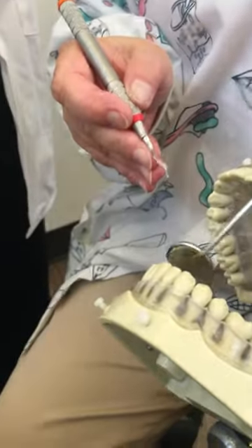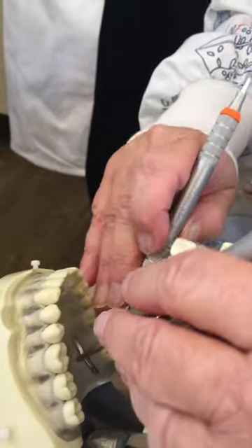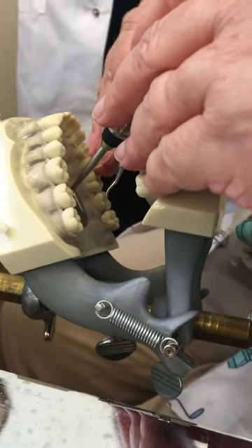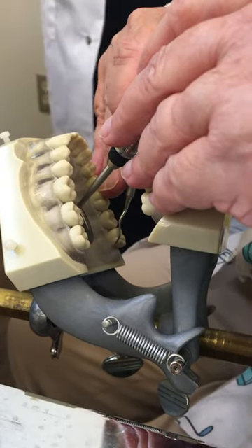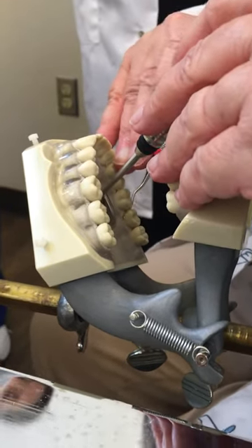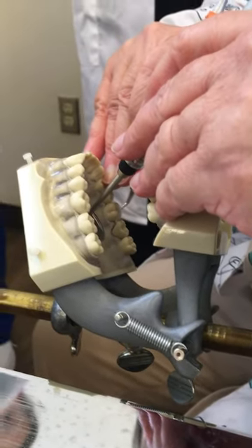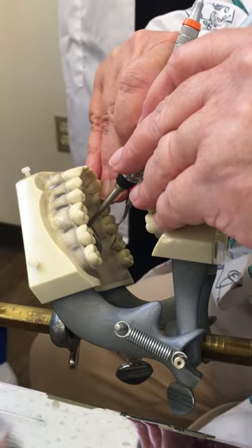For area 6, I'm just going to move back to area 6, and I'm going to look through my handles, go enclosed, and then open. I might bump over these top teeth, and that's okay because you want to get your hand on the lingual. Remember, these mandibular posterior teeth are leaning toward the lingual, so you need to as well.